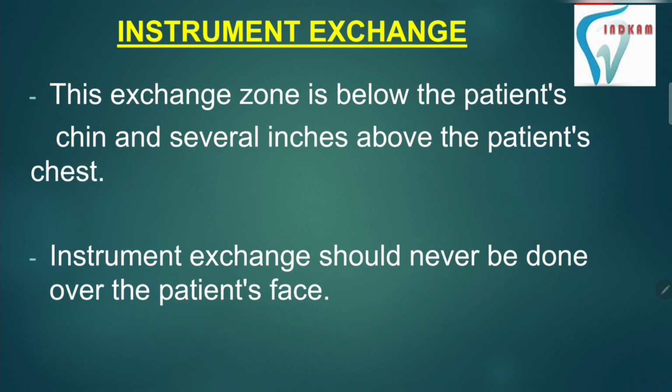So, what is this exchange zone? This exchange zone is below the patient's chin and several inches above the patient's chest. So, I guess everyone got this point. The exchange zone is below the patient's chin and several inches above the patient's chest.